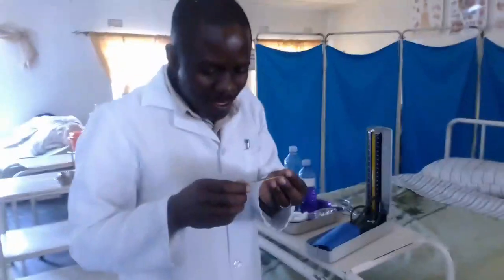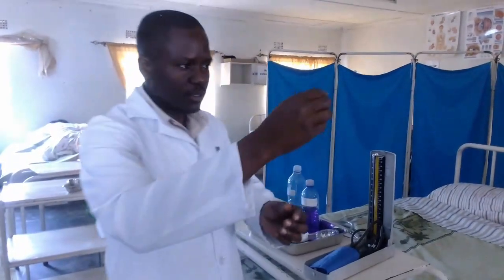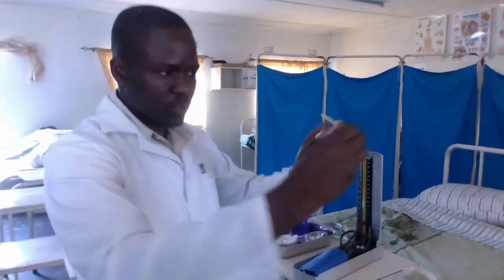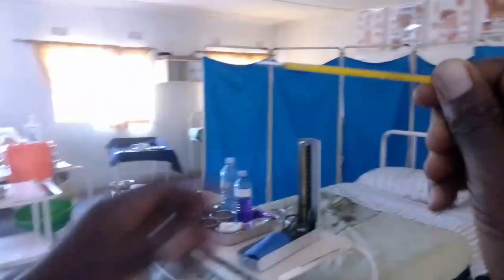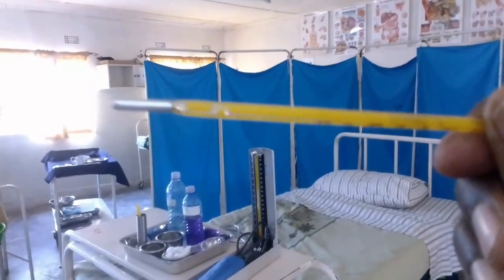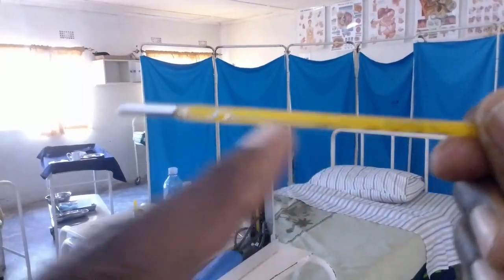Yes. Okay, so you have to get the thermometer. When you get the thermometer, you have to hold it like this. Then you see the level of mercury. So if you can see, like that, at least you see the level of mercury. Mercury is there. That's mercury there.